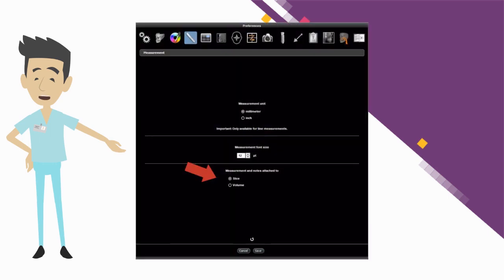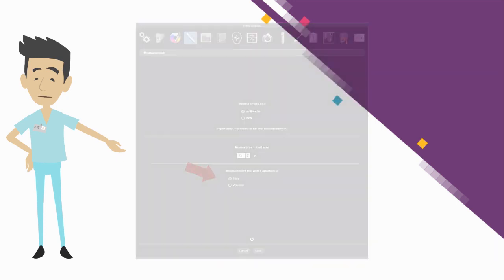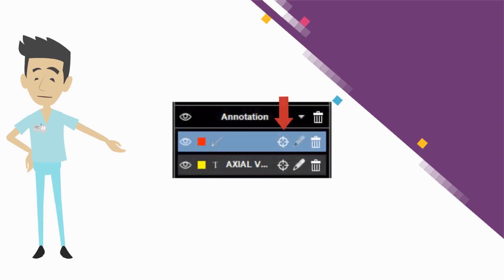A preference setting on the measurement tab is now available to associate annotations with a specific slice or the entire volume. The associated slices can be easily retrieved by clicking on the target symbol associated with each annotation.